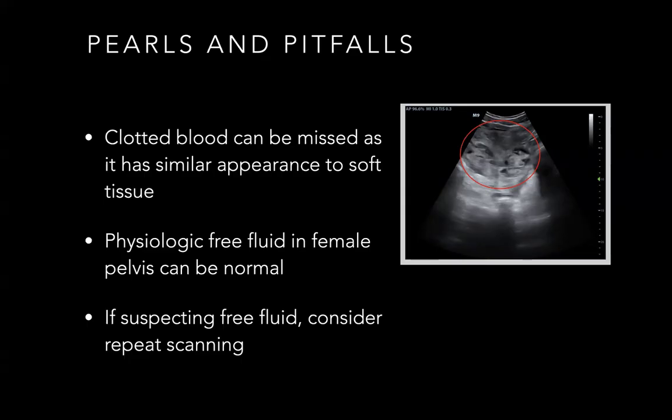It's going to be hard to actually distinguish that under point of care ultrasound. So beware if you're looking for free fluid days after a specific trauma incident, that might mislead you if you see a negative FAST.